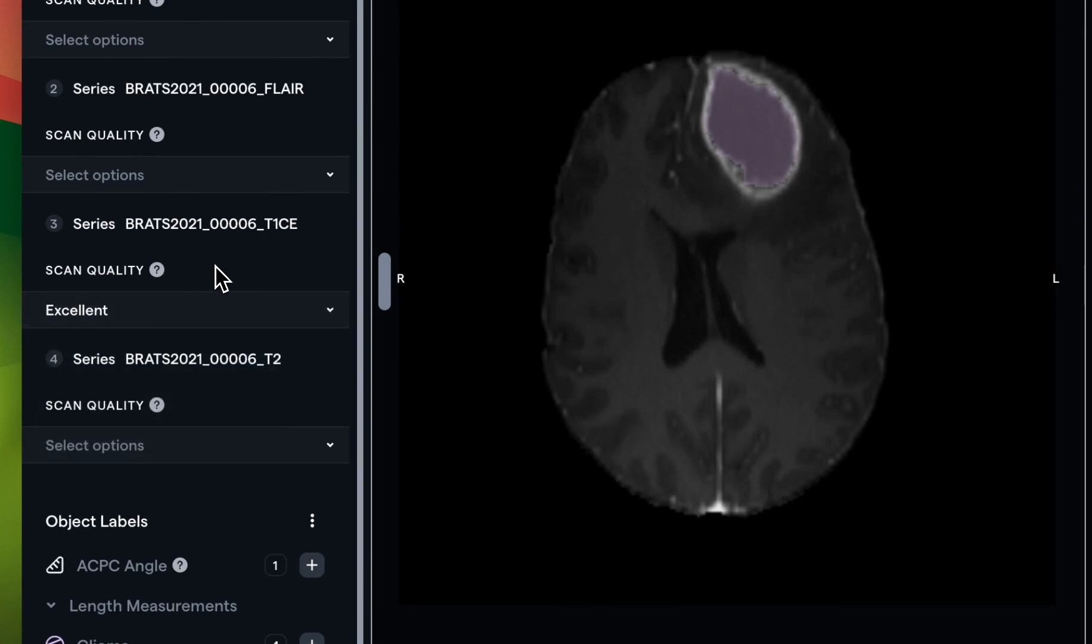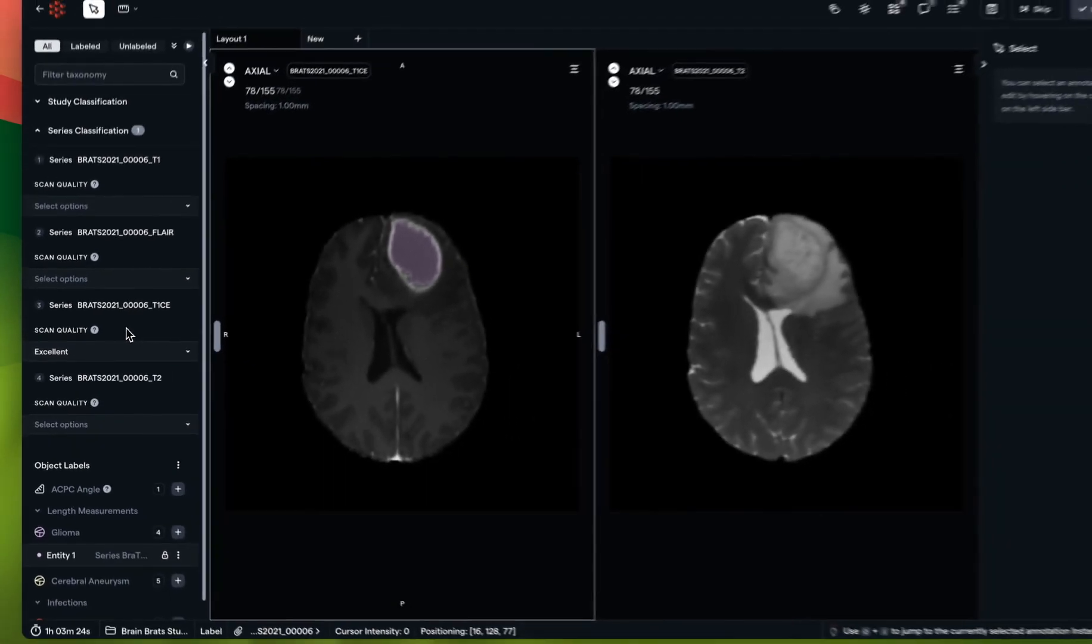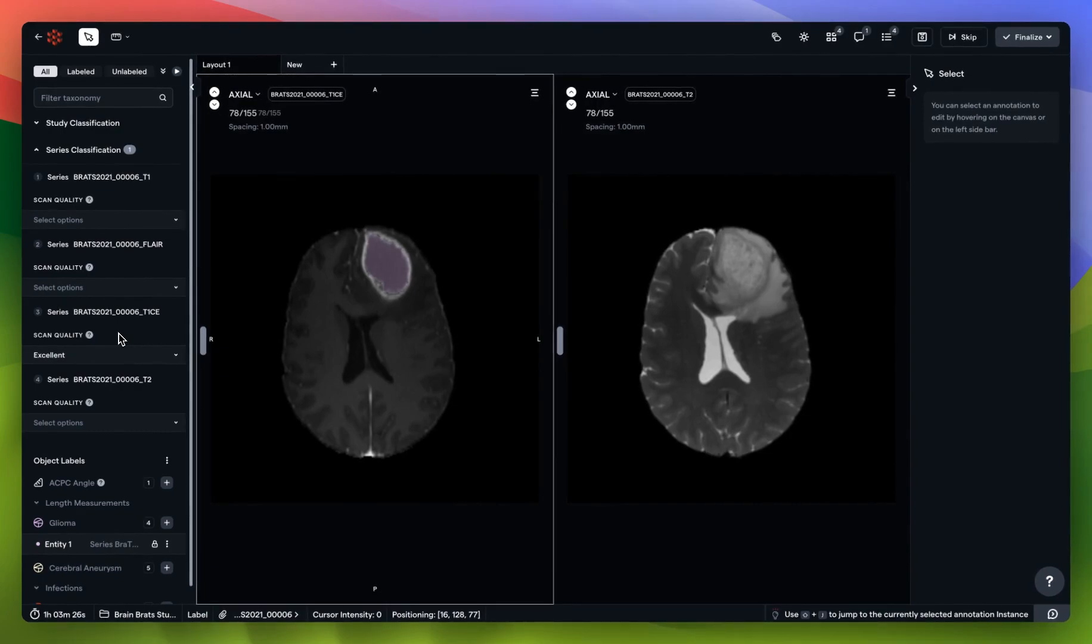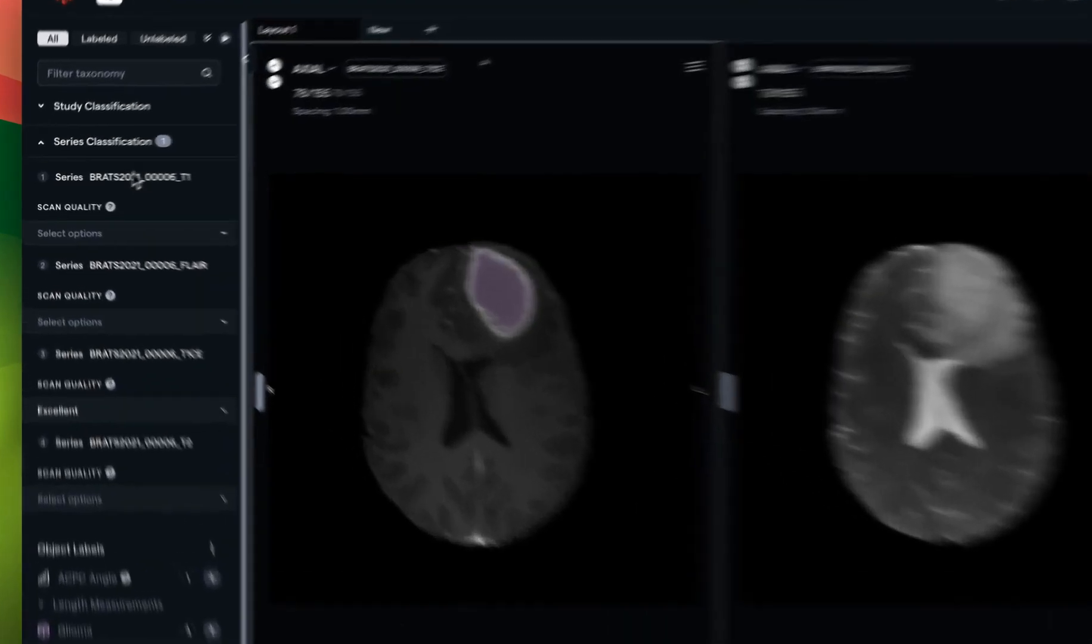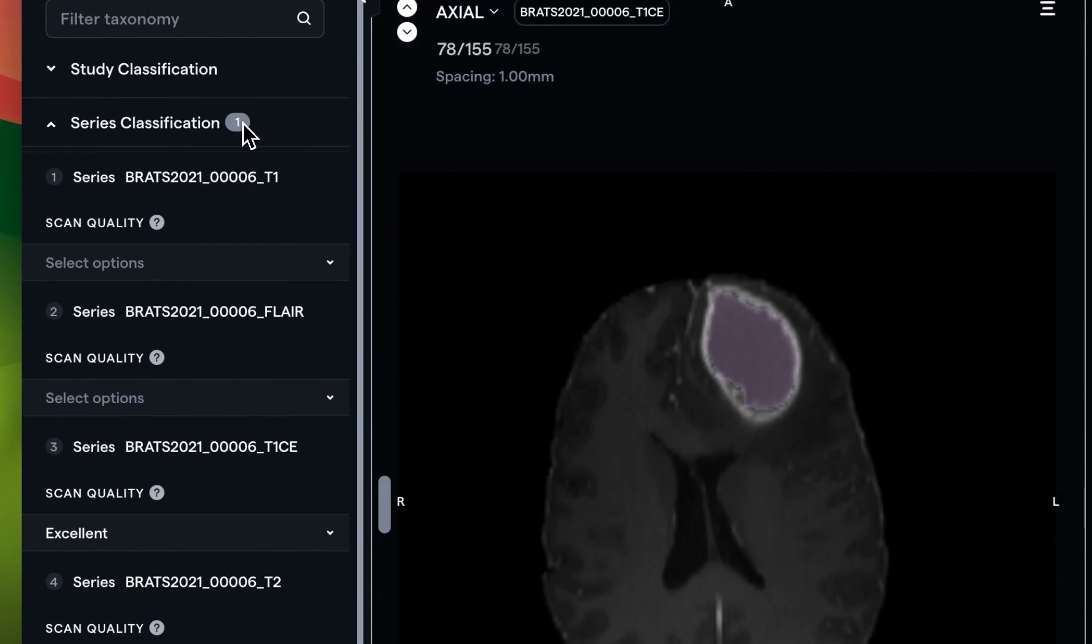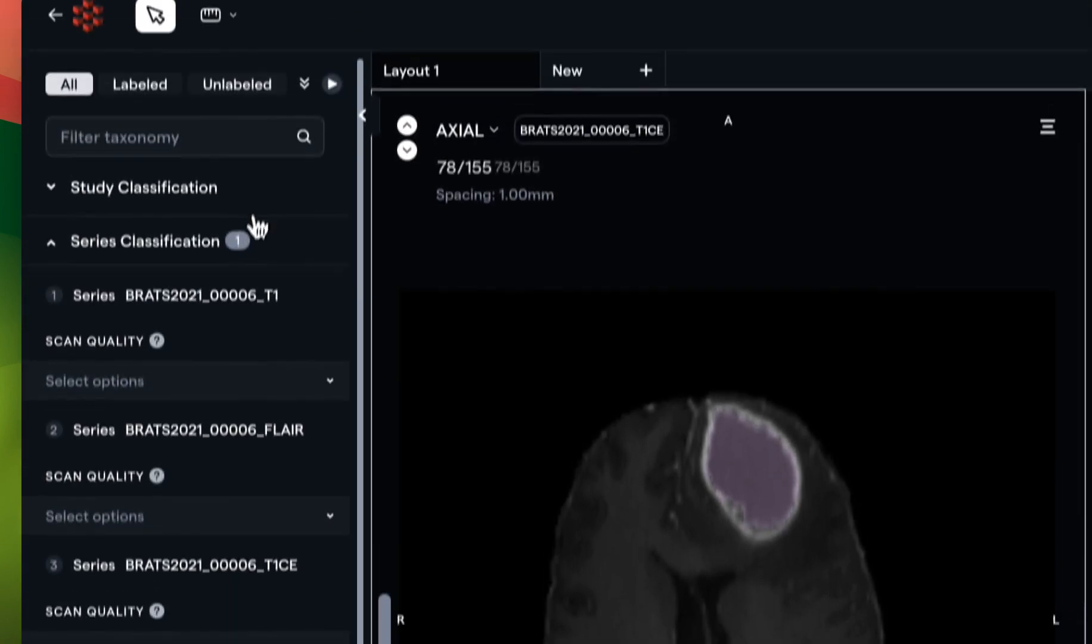Now that data point will be available to our AI team or data science team upon export. You'll see that after I made my choice, that number is reflected next to series classification to indicate that I have indeed created one attribute.